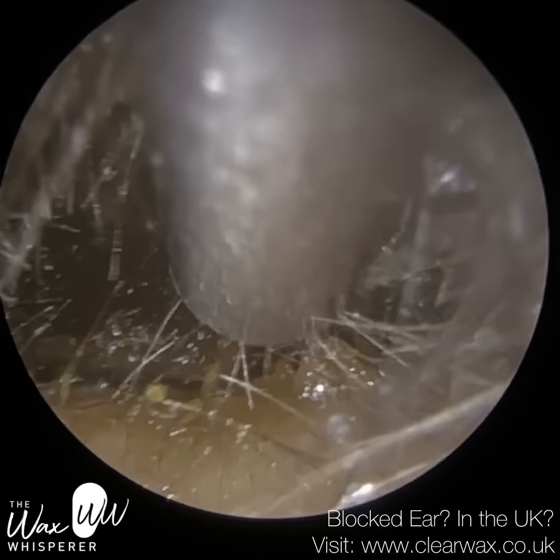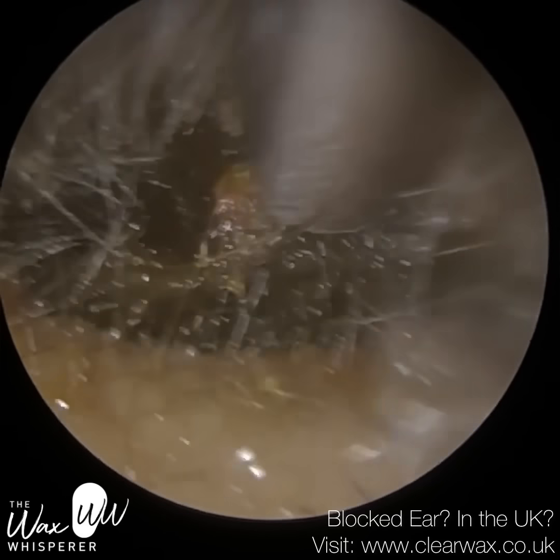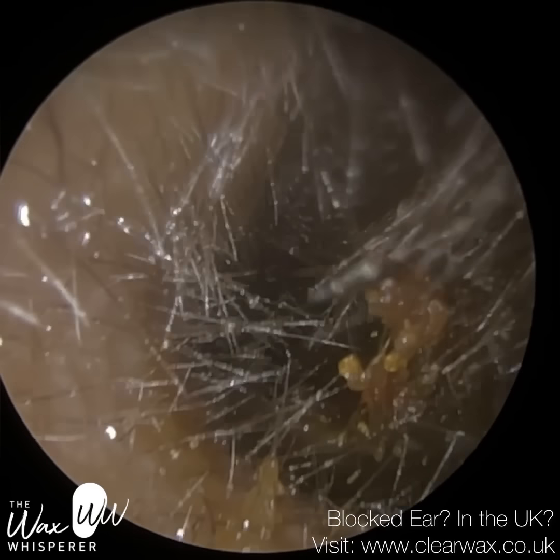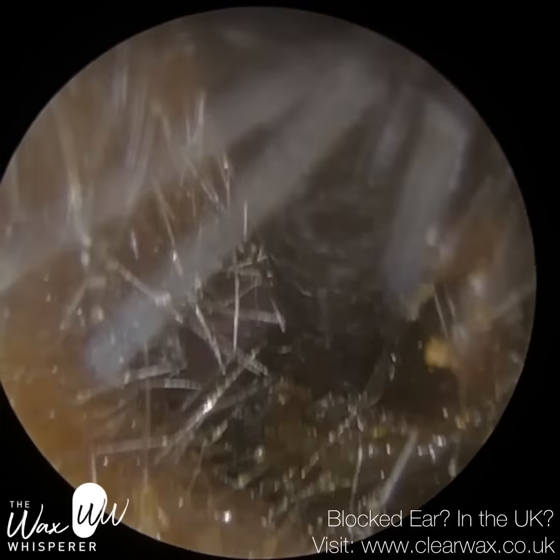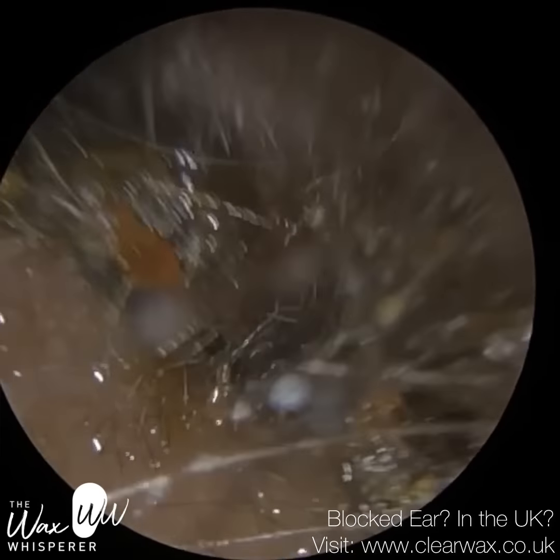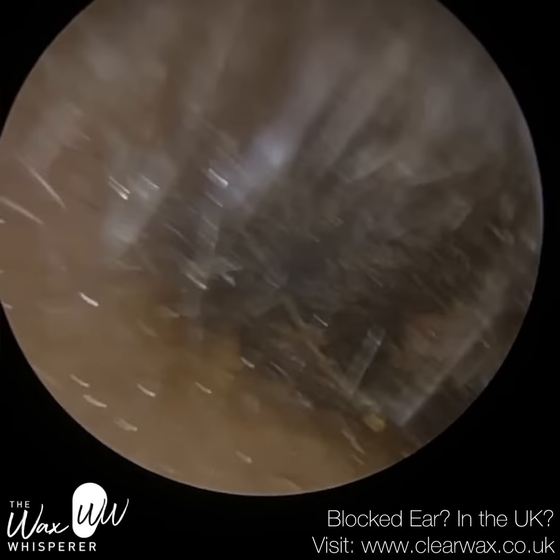I just went in with the curette there and you may have seen that this wax got smeared against the base of the ear canal. The view is slightly wobbly because this patient wasn't the most steady — they were very anxious actually. It's their first time with myself, and sometimes keeping patients still can be tricky, but the longer the procedure went on the calmer the patient became, so it was less of an issue.